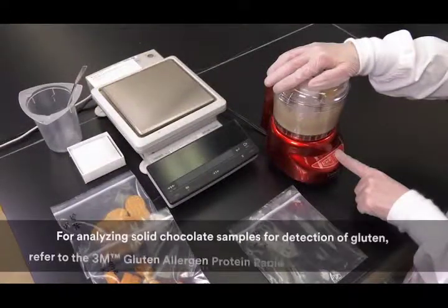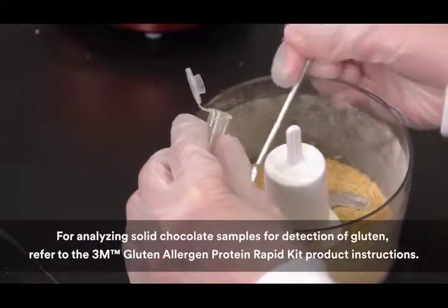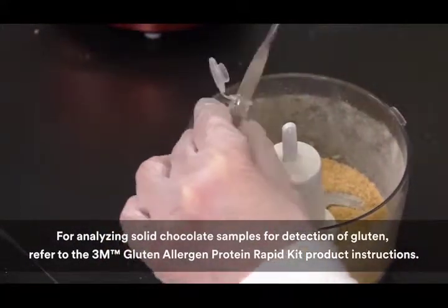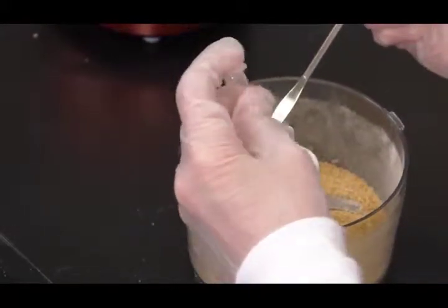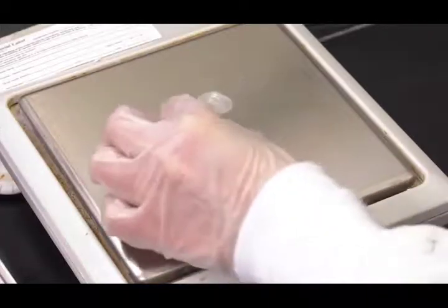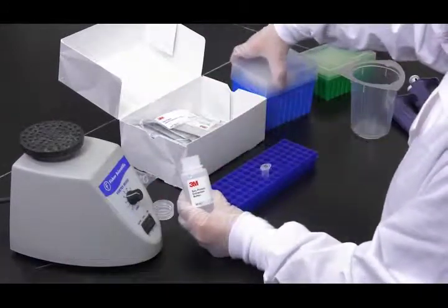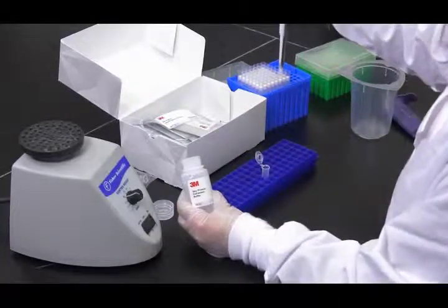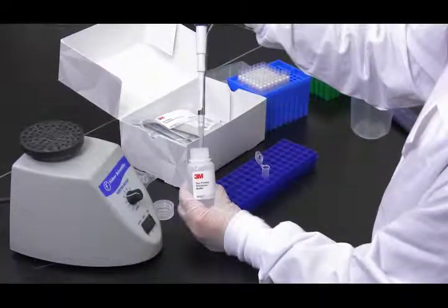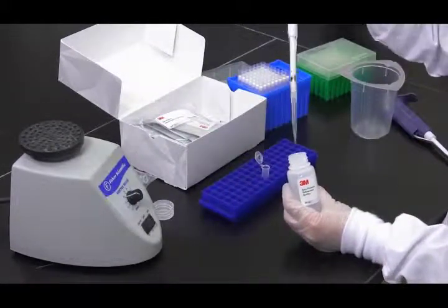Grind a sufficient amount of sample into a fine homogeneous powder. To analyze solid samples, label one microcentrifuge tube for each sample. Next, measure 0.2 grams of the sample into a labeled microcentrifuge tube.